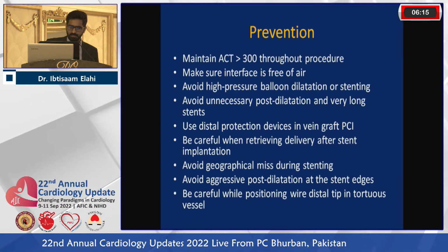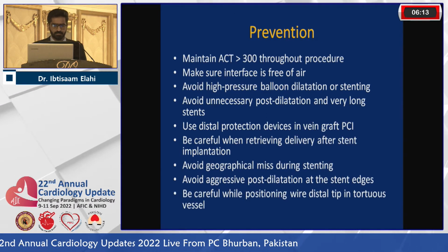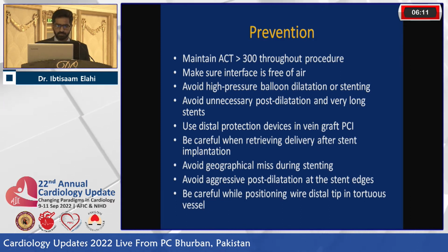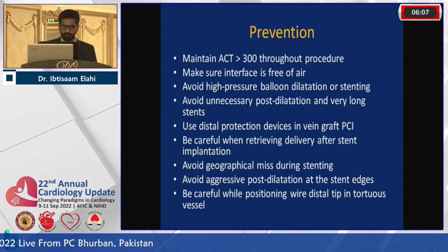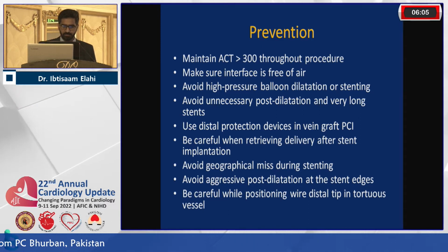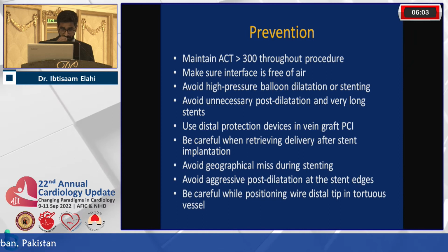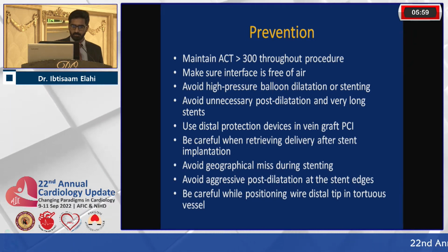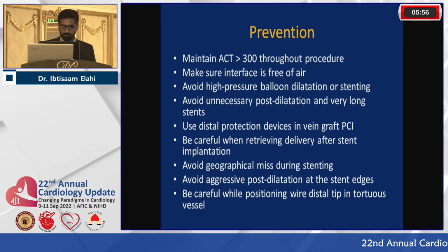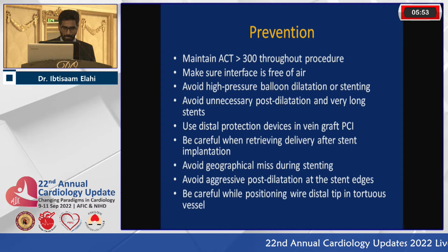Prevention: maintain ACT, activated clotting time, greater than 300 throughout the procedure. Make sure the interface is free of air. Avoid high pressure balloon dilatation or stenting, avoid unnecessary post dilatation and very long stents. Use distal protection devices in vein graft PCI. Be careful when retrieving the delivery system after stent implantation.